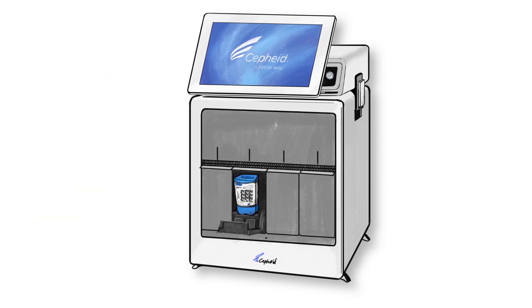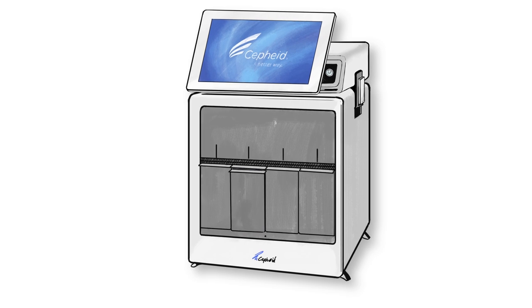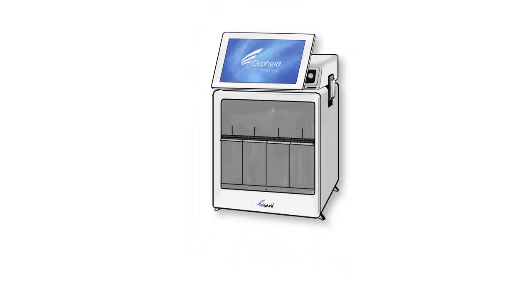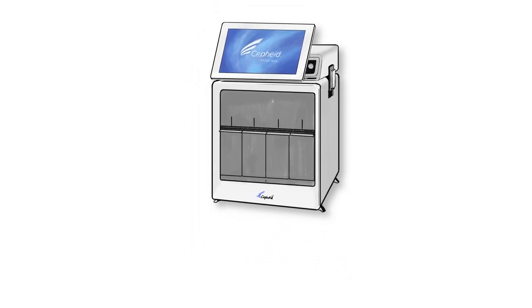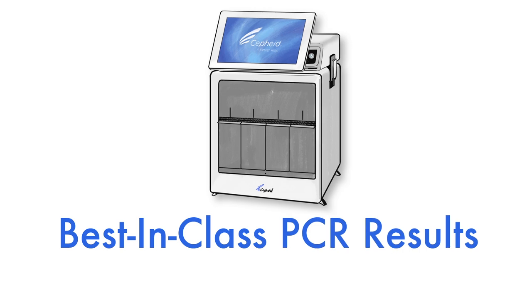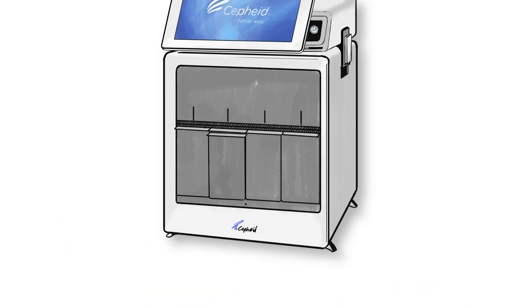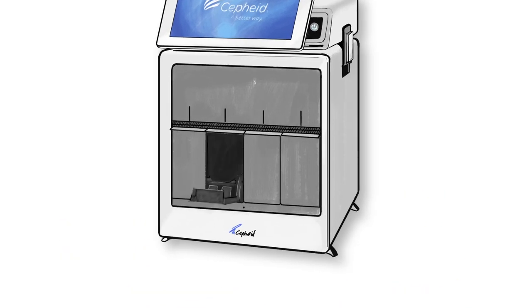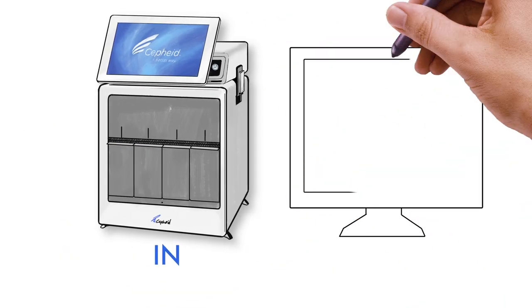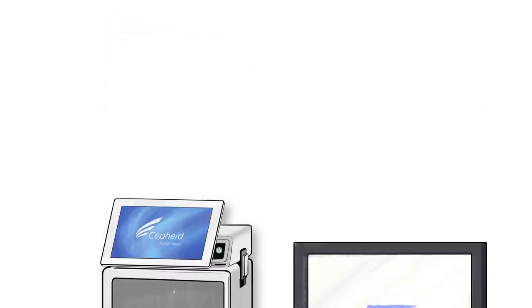There's also the game-changing fact that your most urgent clinical testing needs can now be achieved with a system that delivers best-in-class PCR results. It couldn't be simpler with a sample-in, answer-out operating style.